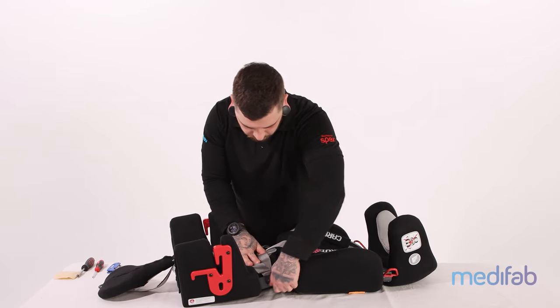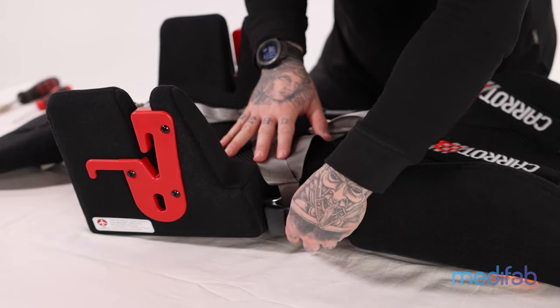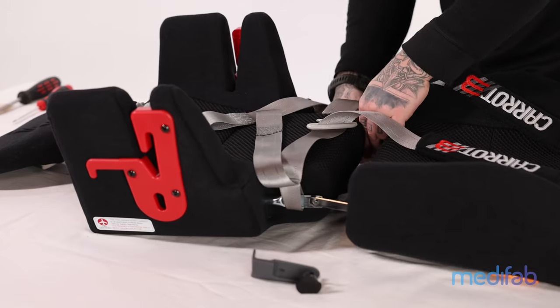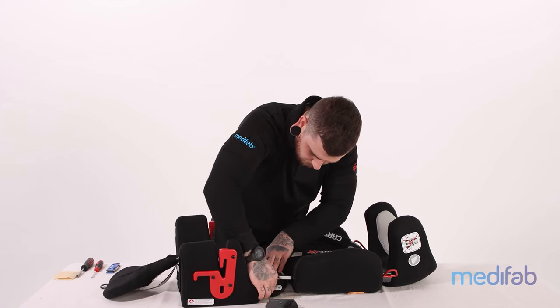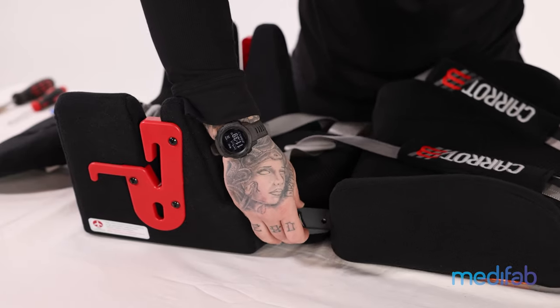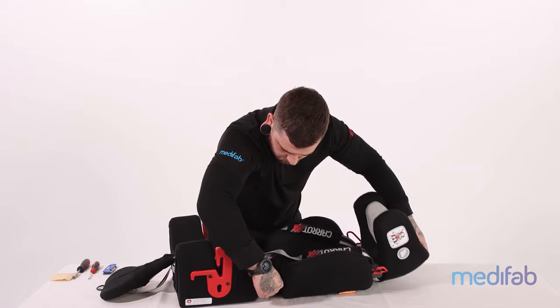Now remove the wing knobs and reinstall in the opposing hole. Insert the wing knobs into the backrest bar and corresponding hole on the seat depth bar.